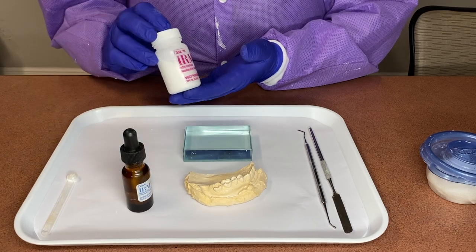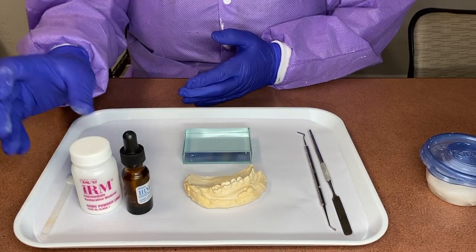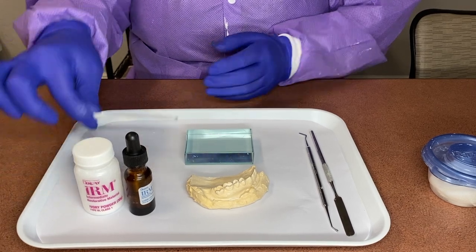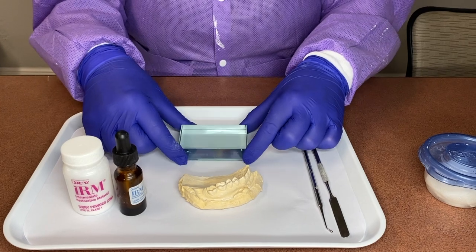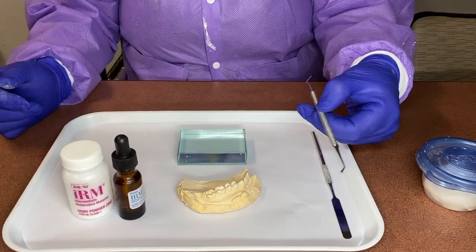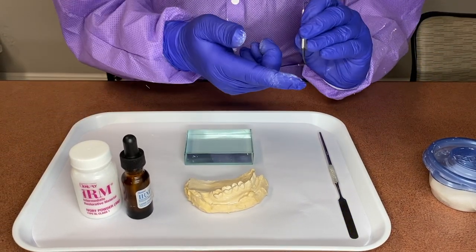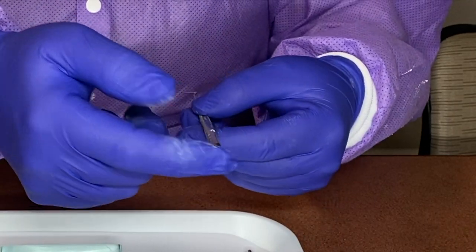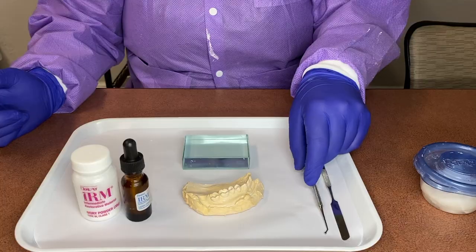So before we mix it, we always want to fluff the material. We have with that a scoop. We have a glass slab. We have a metal spatula. This instrument could be called a beaver tail, a Woodson, a plastic instrument, and it also has a condenser side. They go by many names. They do a lot of the same functions.